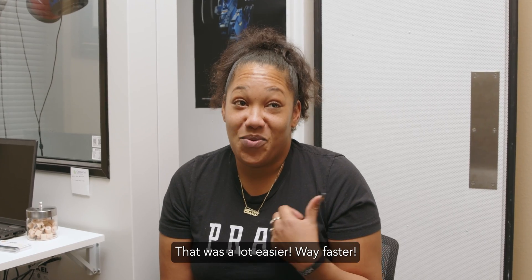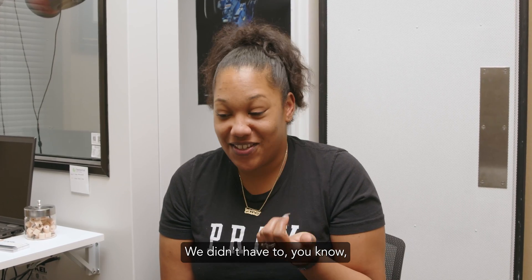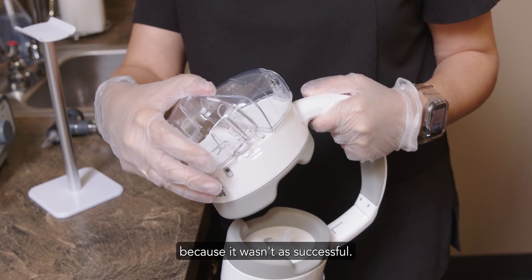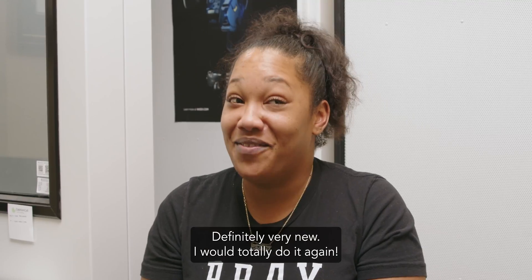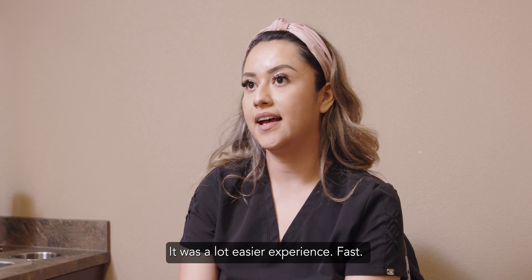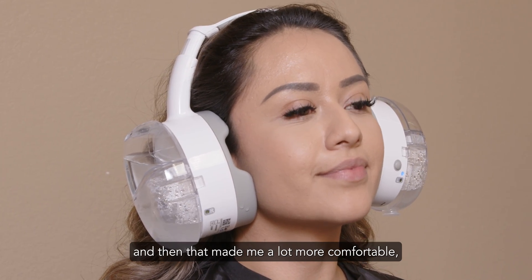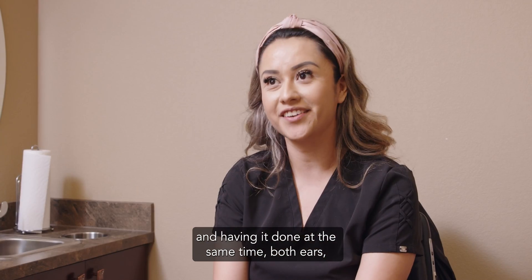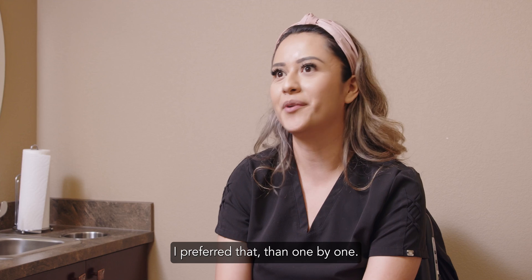That was a lot easier. Way faster. We didn't have to wait for the bottle to get refilled with more water because it wasn't as successful. Definitely very new. I would totally do it again. It was a lot easier experience — fast. It made me a lot more comfortable, just the headset alone and having it done at the same time, both ears. I preferred that, than one by one.